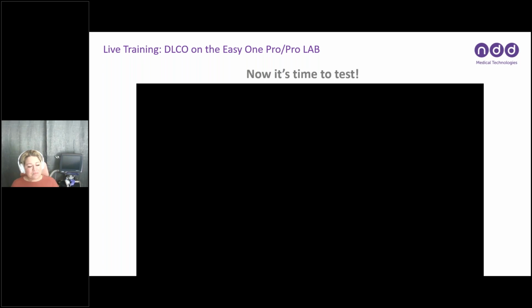All right. Before we do this, I'm going to pause sharing my screen for just a moment so that I'm a little bit bigger on your screen. But having to do a screen to a camera is sometimes a little bit difficult. So I actually am going to play you a video that I recorded off of my Pro at an earlier time. But there are a few steps that we need to do on our Pro to transition from spirometry to the DLCO test.